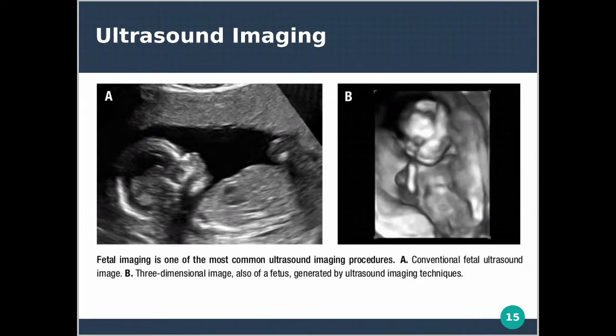Now, the one thing about ultrasound, unlike CT scan, is that they are quite grainy. The picture is a bit blurred, and there are a lot of grainy effects. And then you have the 3D ultrasound. Again, in a similar way to how the CT scan was generated, with multiple detectors at multiple angles, and then the computer builds up the image.